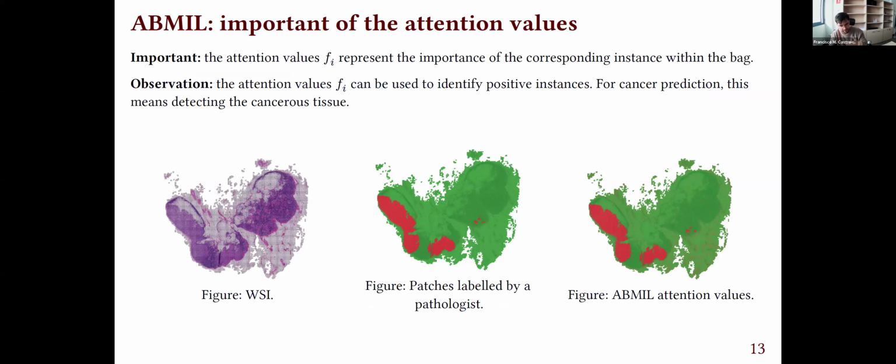But if you have a meaningful representation of the patches and a good multiple instance learning model, it will still be able to localize somehow less easy areas or patches. So it will still work, but it will depend on the application.